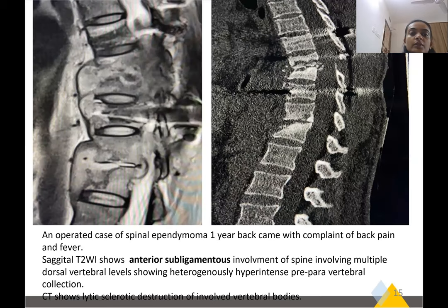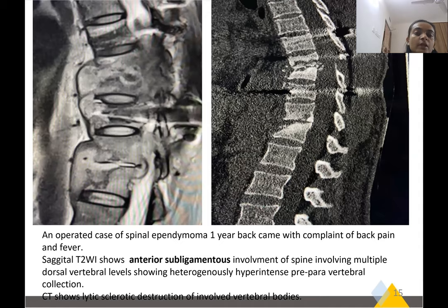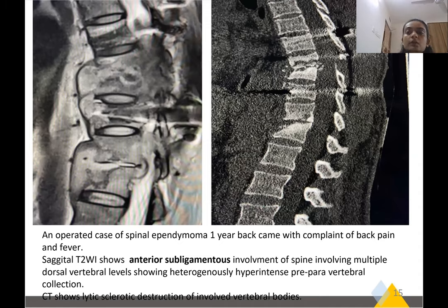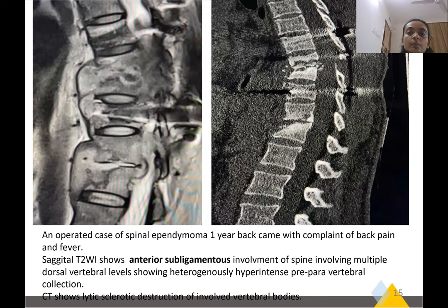Another patient with a history of ependymoma who after one year complained of back pain: there is an anterior subligamentous collection and paravertebral involvement. There is destruction of the vertebrae, appreciable on CT. This is a gibbus deformity.